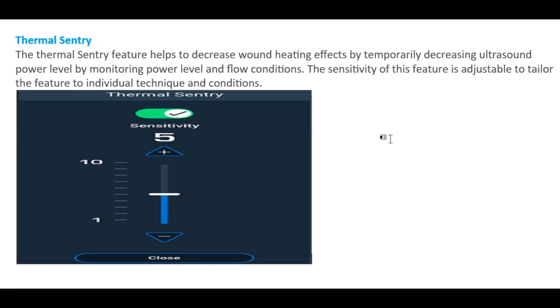The next feature is Thermal Sentry — a thermal safety mechanism for your wound. Continuous use of ultrasound power can lead to wound burn and thermal injury. The Unity machine has a new feature that can sense when the wound is heating and temporarily decrease the ultrasound power.